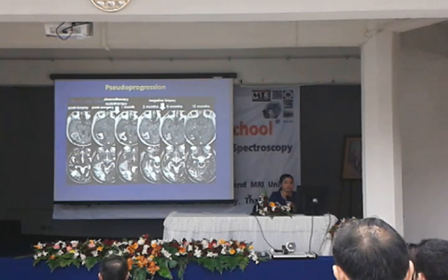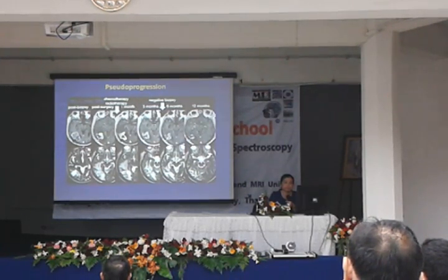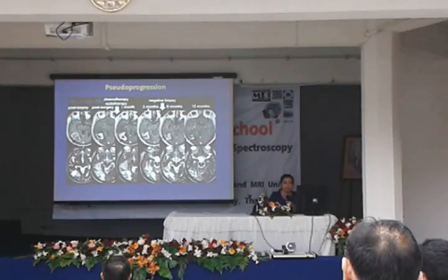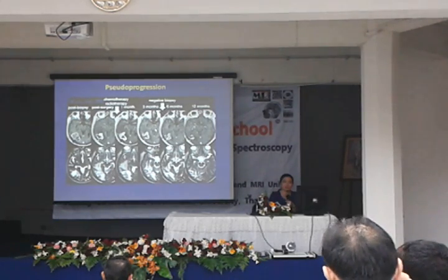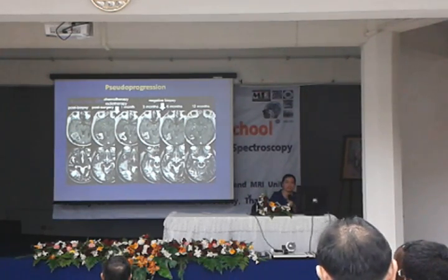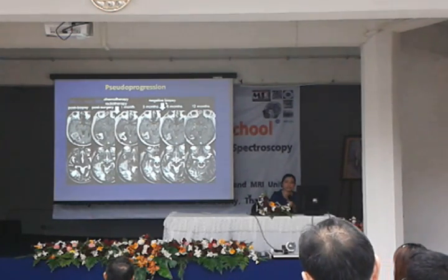For example, this case, a 56-year-old man with high-grade brain tumor. At about 3 months post-treatment, the mass gets bigger, right? And the clinician tries to think about whether this is recurrent or post-chemotherapy change. They checked the biopsy and the biopsy is negative.